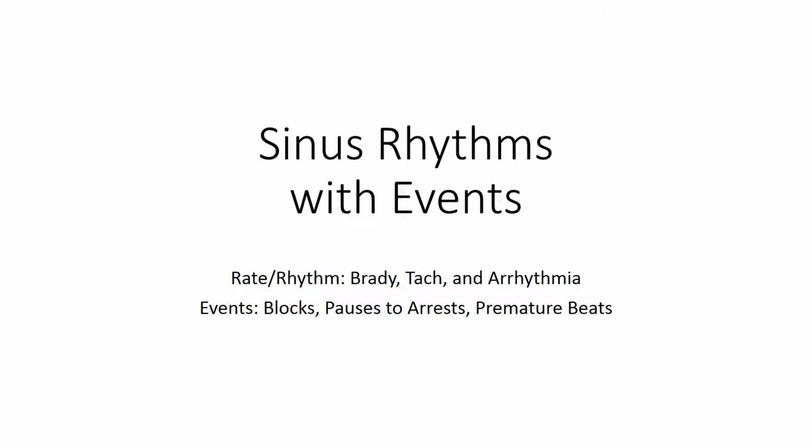Today we're going to talk about the different types of sinus rhythms, as well as introduce cardiac events that are important to understand in EKG rhythm interpretation.